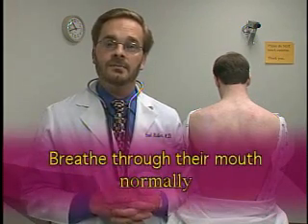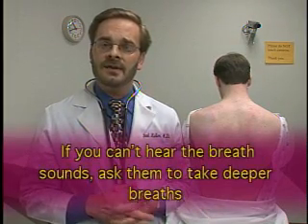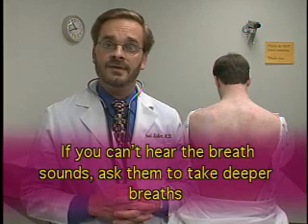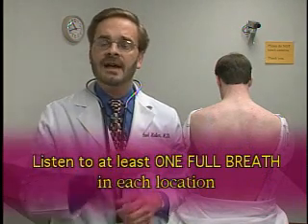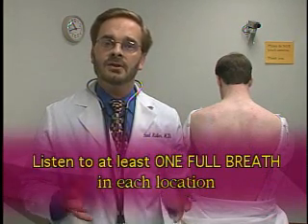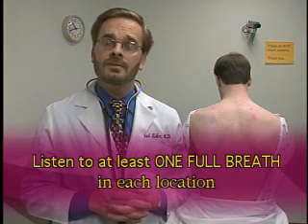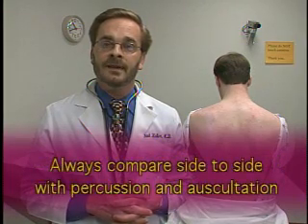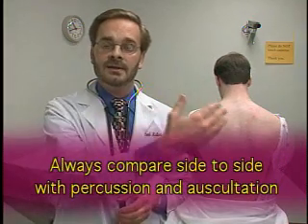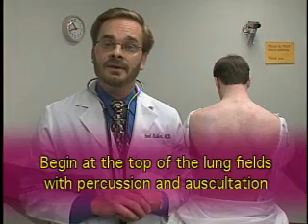Ask the patient to breathe through their mouth and breathe normally initially. But if you're unable to hear the breath sounds, ask them to take deeper breaths as you listen and auscultate the lung fields. Remember, don't move your stethoscope too quickly from one side to the other — let the patient go through a complete respiratory cycle before you move. A common mistake is that students move before the patient has completely finished exhalation. Always compare right to left at any given level and start at the top of the lung fields.